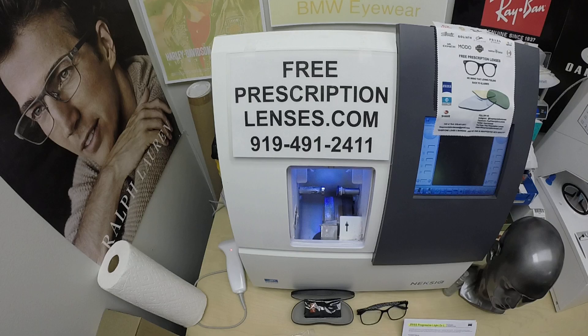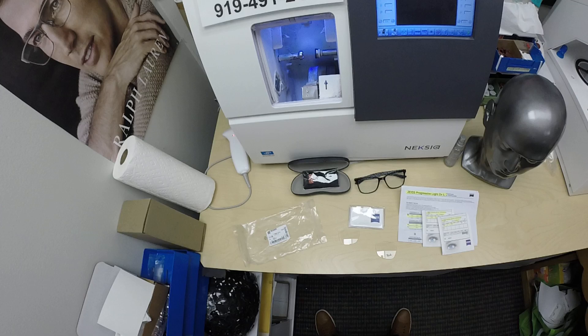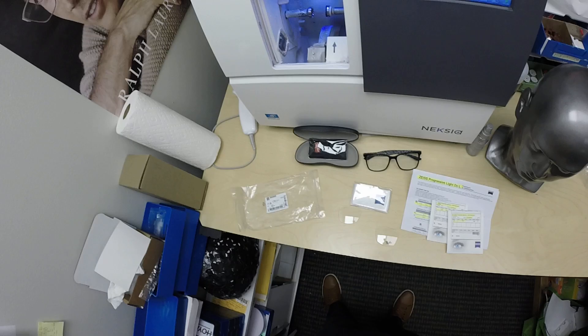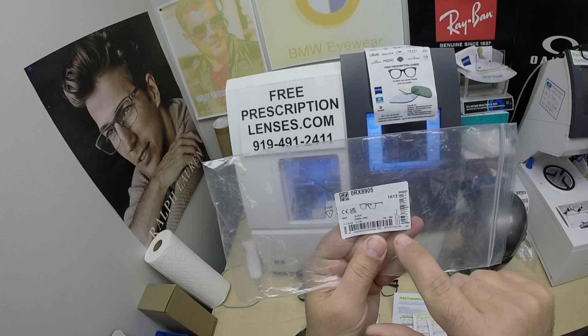Hello everyone. A special thank you to Mark in San Diego, California. This is freeprescriptionlenses.com where everyone loves a bargain and no one is disappointed with quality. I am the optician behind the lens. My name is Seymour Better, but call me Moe, Moe Better, because I'm going to have you seeing Moe Better, looking Moe Better, and show everyone else how I bring that loving feeling back to glasses when I show you Mark's Ray-Ban 8905.